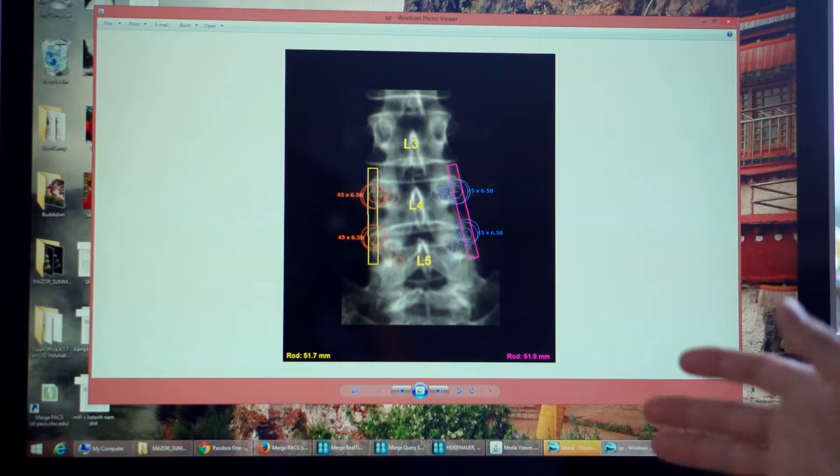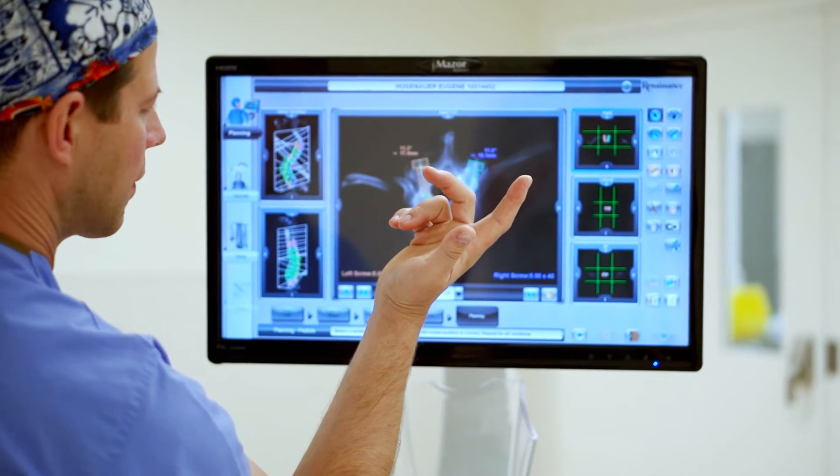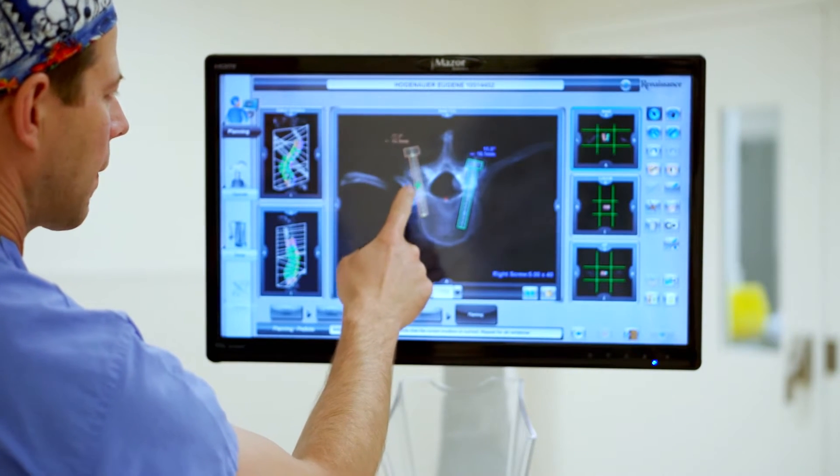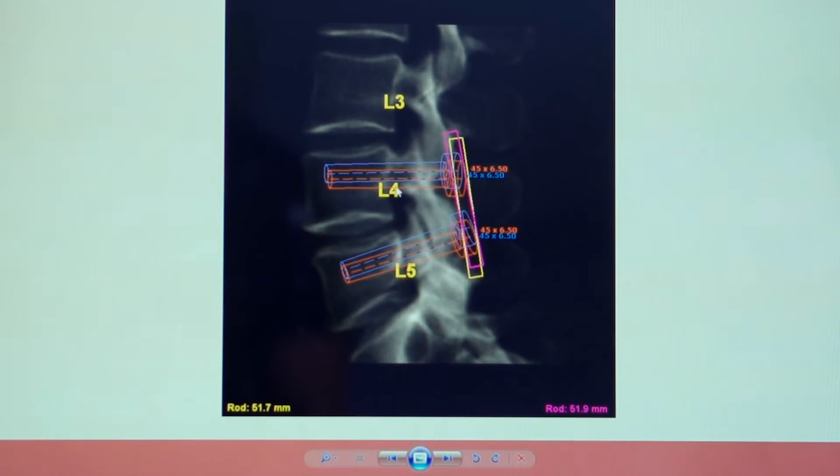What it does is it duplicates my own plan. The day before surgery, I load the CT of the patient's spine into the computer, and then I segment it — I break it into levels. Then I do what's called virtual screw placement. Those are virtual screws that I've placed in the L4 and L5 vertebra. I've pre-selected the length and the diameter. This is the blueprint that I will take to the operating room with me.